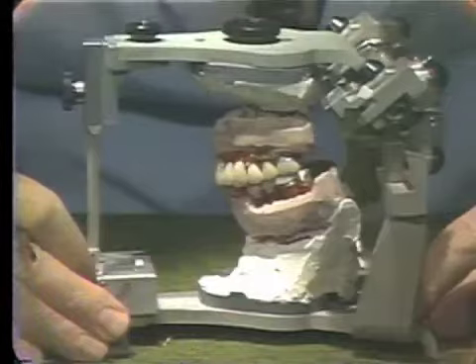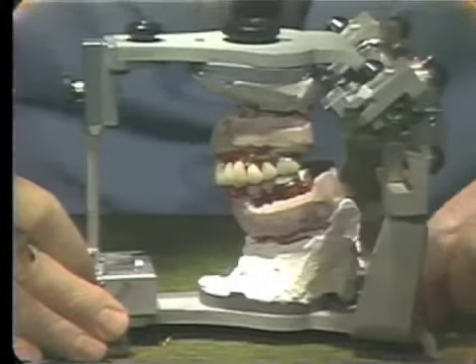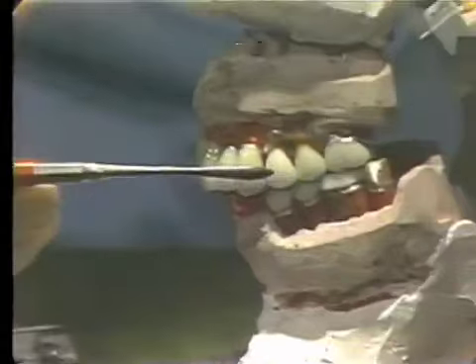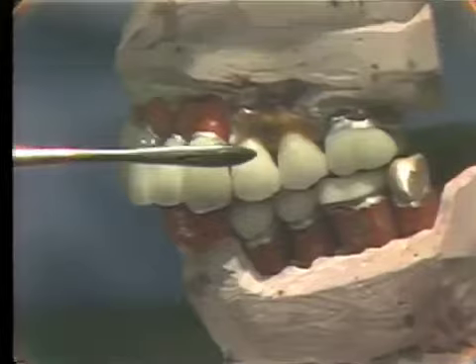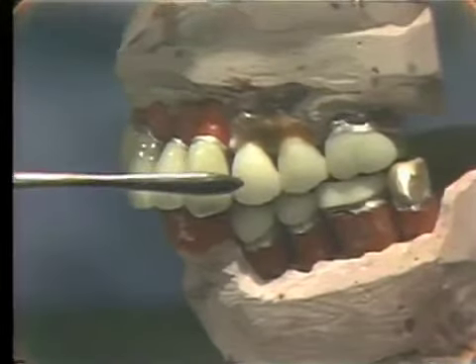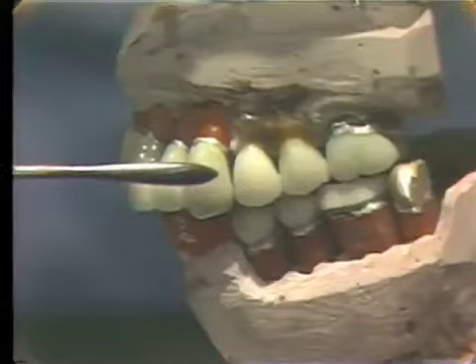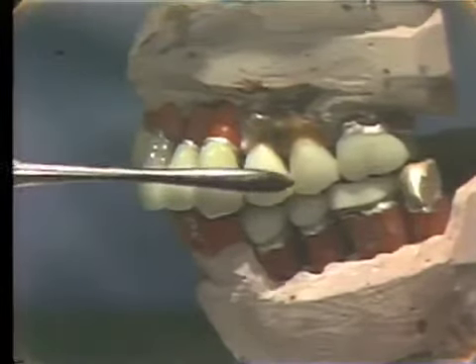The case has been returned from the laboratory. We have had the posterior teeth cast, and we have our porcelain on these teeth in a biscuit bake. We now have the case back so that we can go to the mouth and trim the porcelain the way we'd like, so we have this in a biscuit bake. The bridge on this side will have to be soldered to the cuspid here after we do the baking or the glazing of the porcelain.